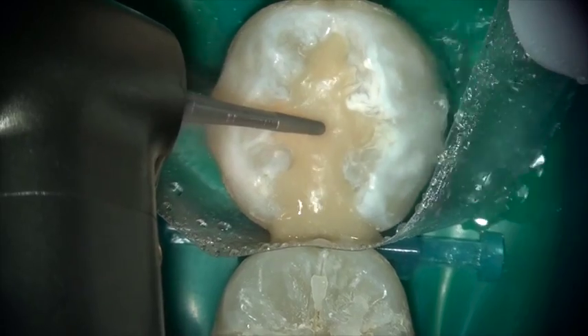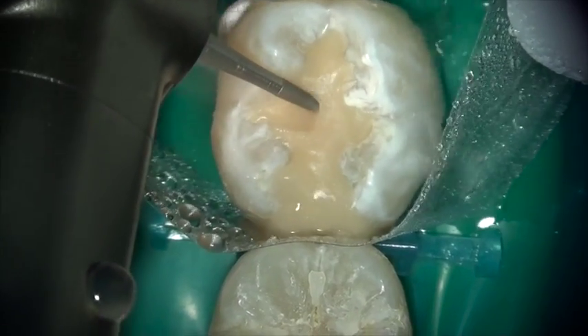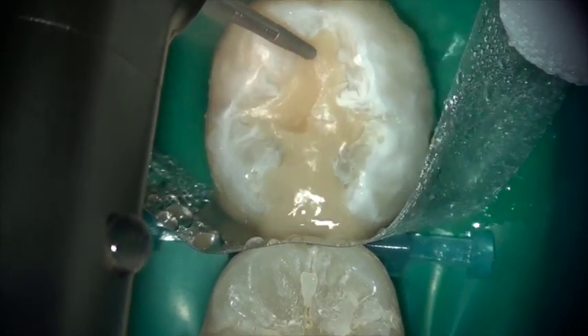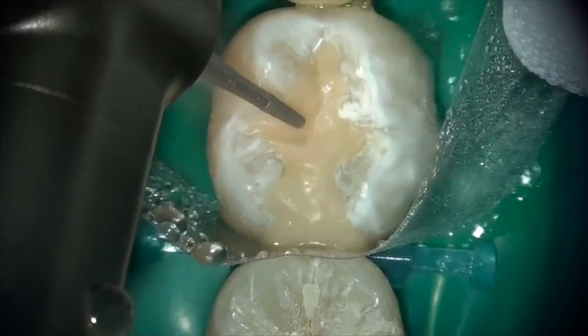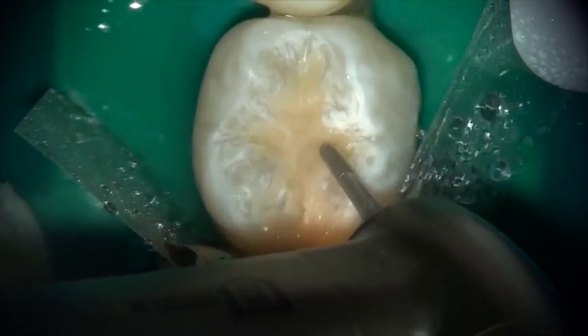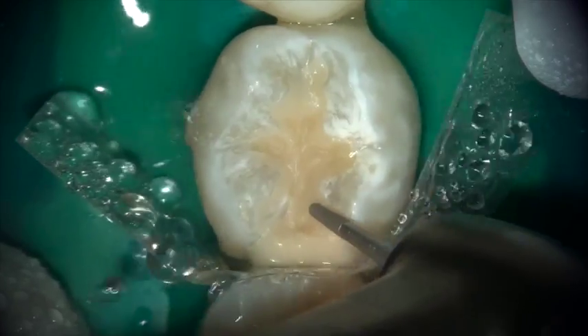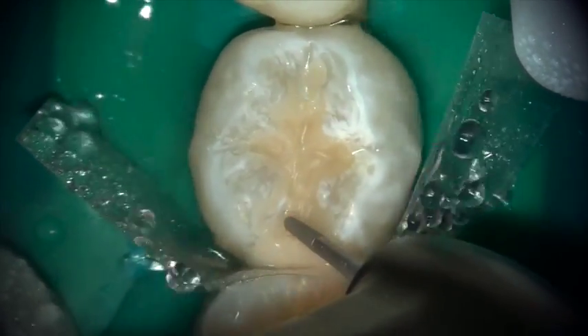Once the material is set, in a slower RPM handpiece using fine diamonds, the material sculpts beautifully. It carves well. And as you'll notice, as the material is carved and adapted to the tooth, look how well it picks up the natural color of the tooth.